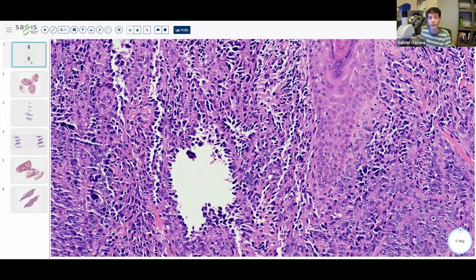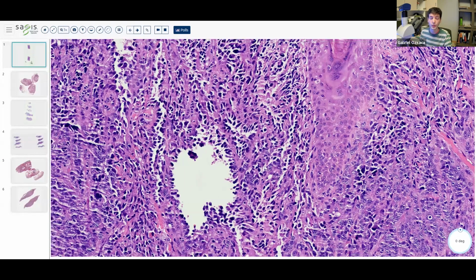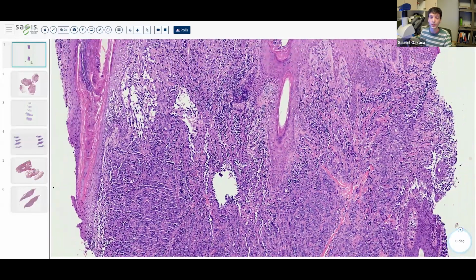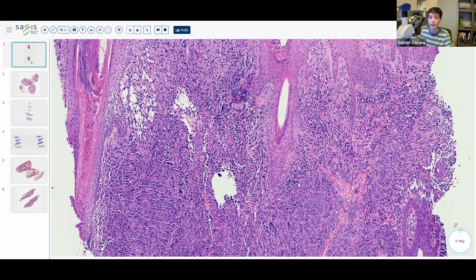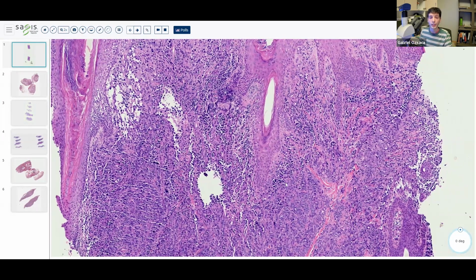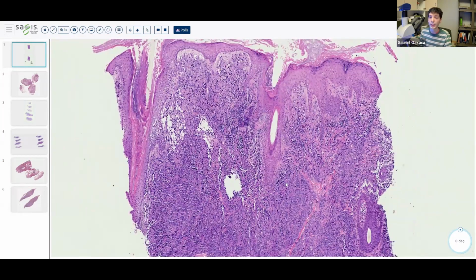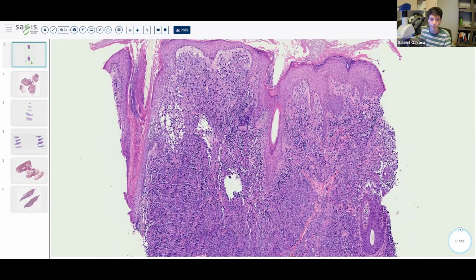And so some quick tidbits on angiosarcoma. They are most common on sun-exposed skin in elderly individuals. And there are two different pathways, if you will, for angiosarcoma. One is radiation/lymphedema, and then this one is sun damage associated.